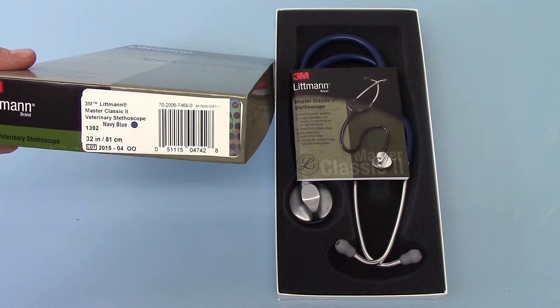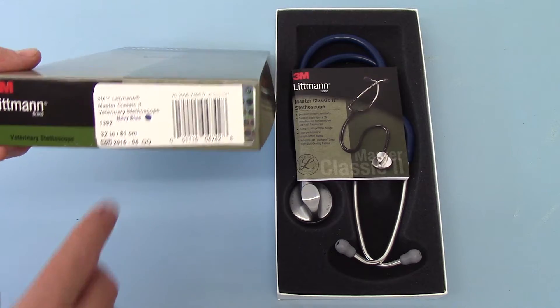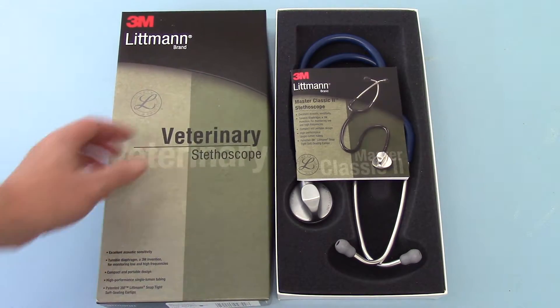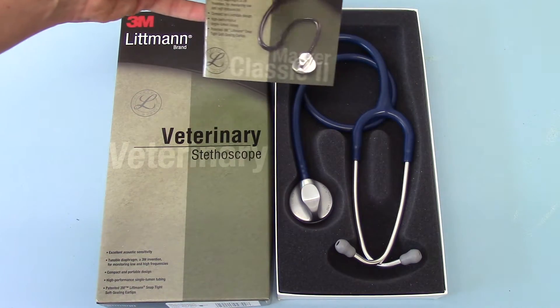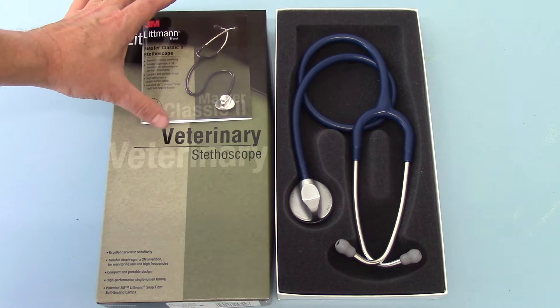This is a slightly longer tube than the medical stethoscopes — it's 32 inches, 81cm. And this is the pack contents you get when you buy one: the Littmann 3M Master Classic II User's Guide.